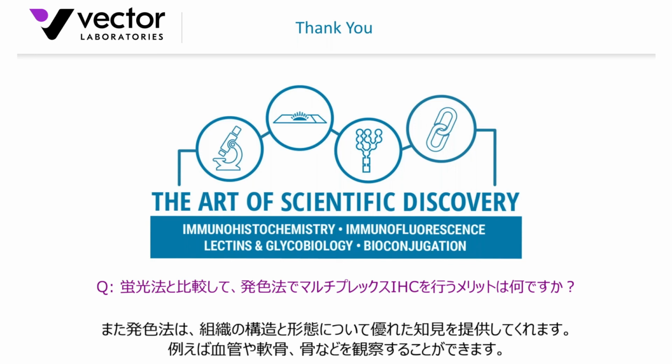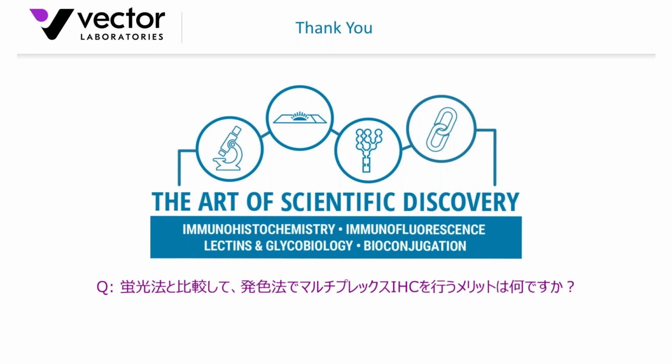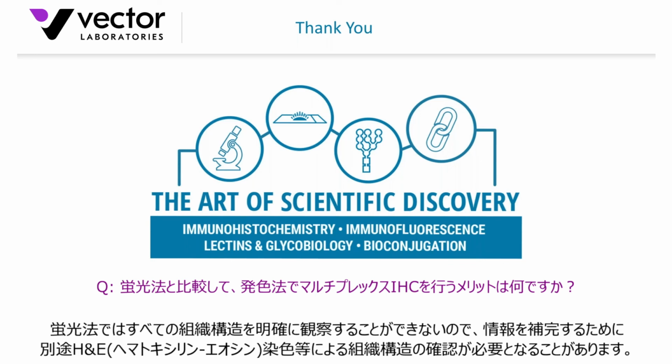I would say also that the chromogenic methodology still gives you a great idea of some of the underlying tissue architecture and morphology. You can see adjacent blood vessels, cartilage, bone, things like that, other structures that might not be evident in immunofluorescence, and you might be only seeing half the picture with that, unless, of course, you did an adjacent H&E.